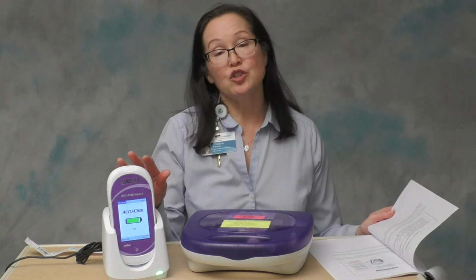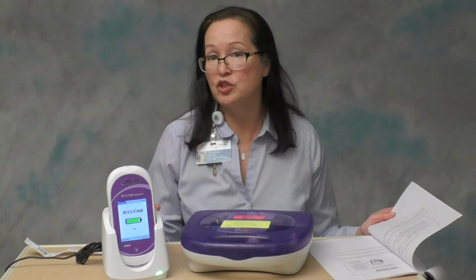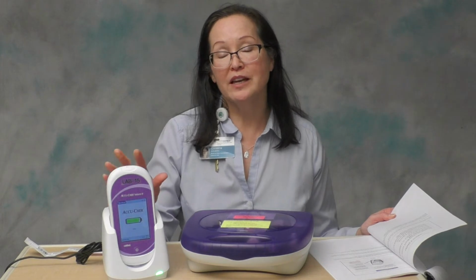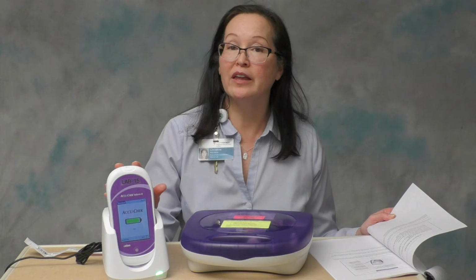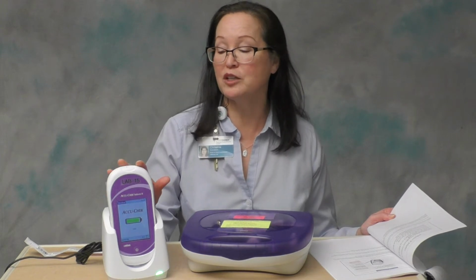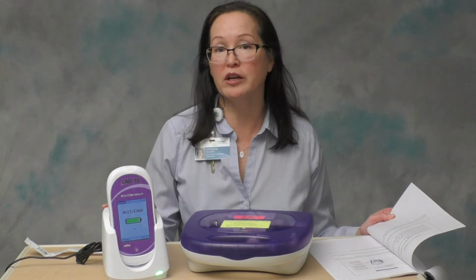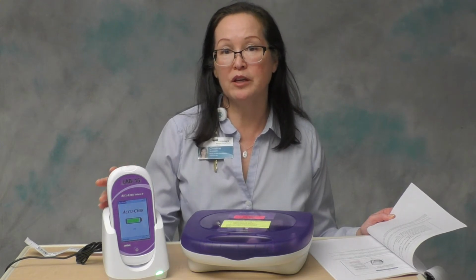These meters have a rechargeable battery. For that reason, they need to be stored in their recharging base. That's how the battery gets recharged. The number one problem we have with the meters is they don't get docked correctly and the battery gets drained, and then the instrument is not ready for use when you need to use it. So make sure that you dock it correctly and observe that the screen indicates that it is in its proper docking mode, and that will ensure you that it's being recharged.